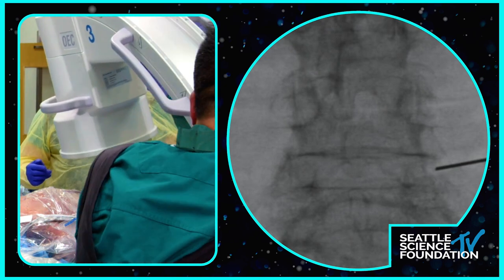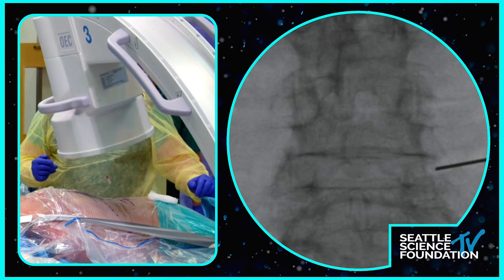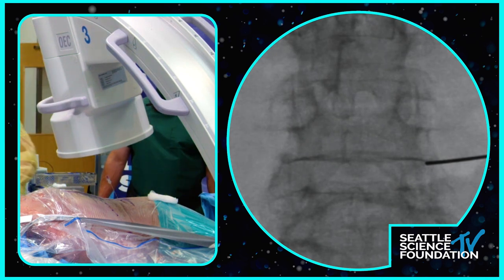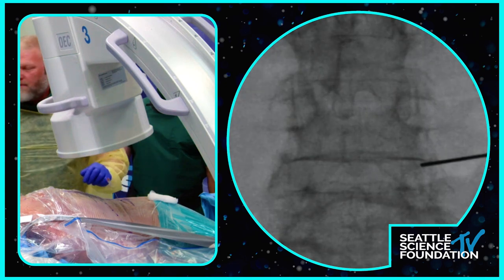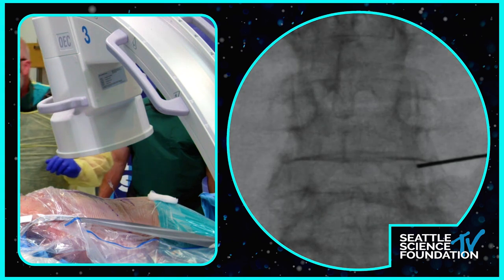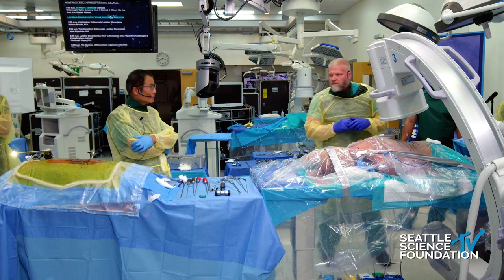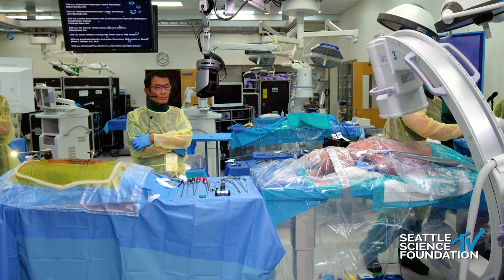Back to the same spot. Yeah. So kind of just over the pedicle. Shot there. One more. All right, so I'm a little bit medial on this approach, but that'll be okay because I can do a foraminotomy and medialize it. And then this is like anything else: guidewire.